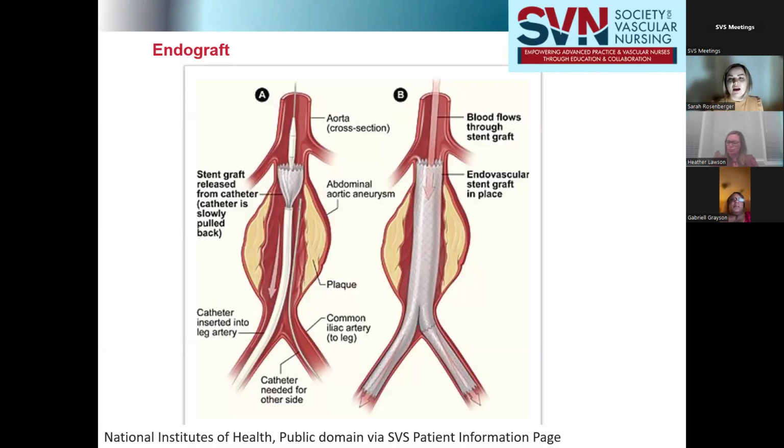So the purpose of endograft is to prevent rupture. And rupture occurs because the sac is pressurized and this weakened wall cannot withstand the pressure. So the endograft uses radial force. It's pushing up from the inside against the wall of the aorta, directing blood flow through this stent graft, thereby depressurizing the aortic sac. So eliminating the risk that the sac would rupture because it does not have an increased pressure that's pushing outward force.